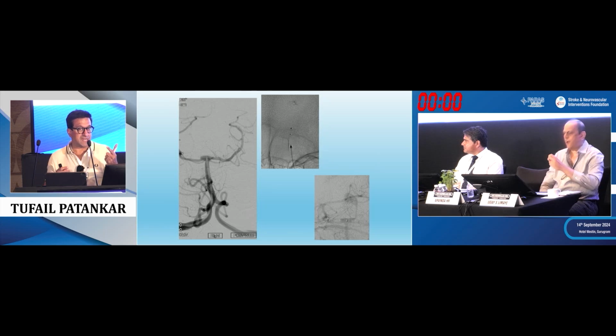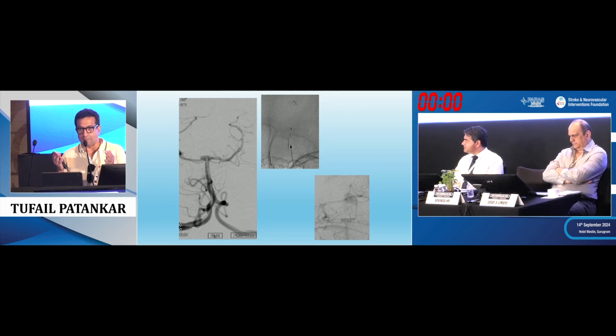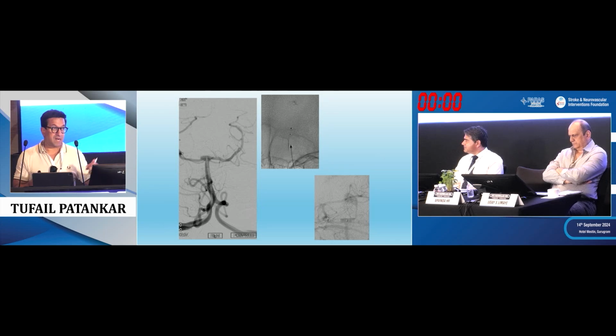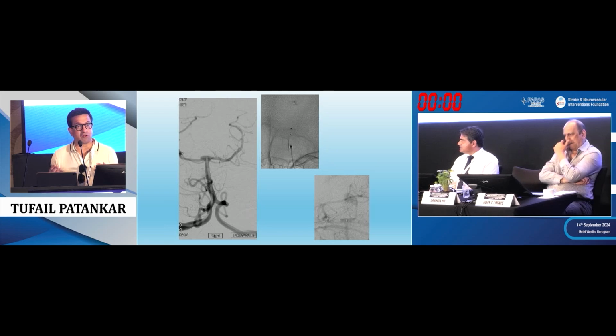So symptomatic is small, which is why I give perioperative antiplatelets, because I know that I get thromboembolic events. I do get thromboembolic events with Contour too, because I come down into the neck, okay? And you have a braided device, so I give it. But we have done so many webs, and we know that you get thromboembolic events. Delayed recurrences, you're going to get with both. A complete occlusion in both techniques, both technologies, I think it's around 60%.